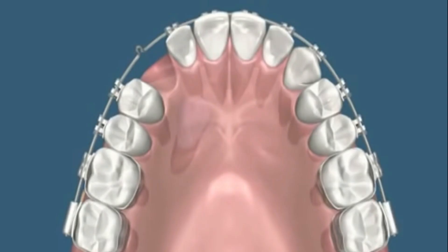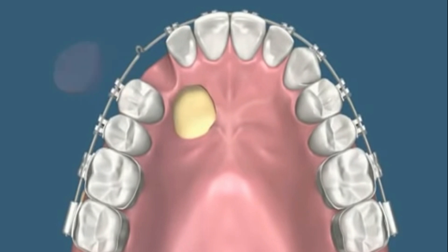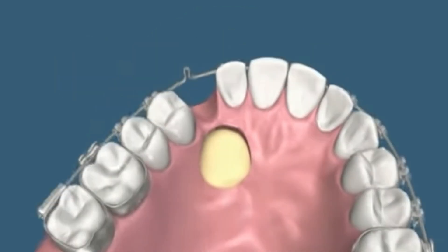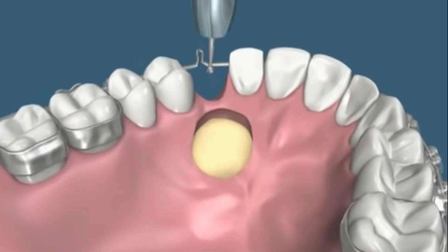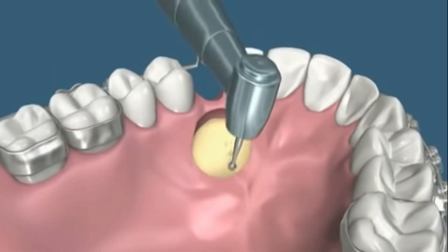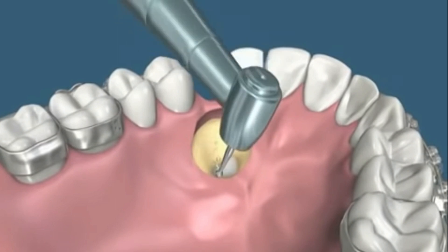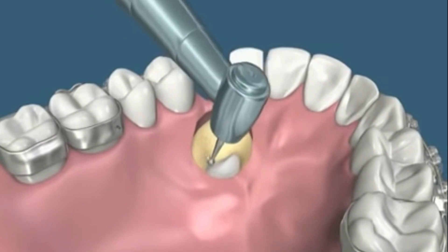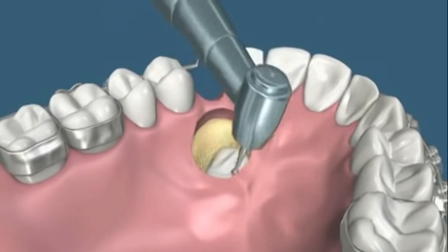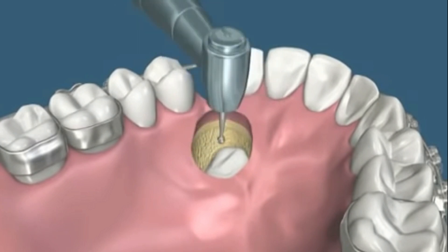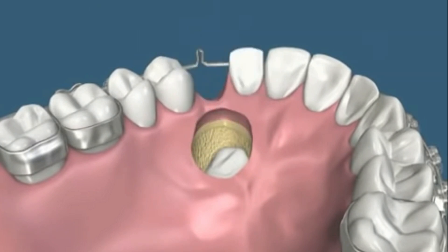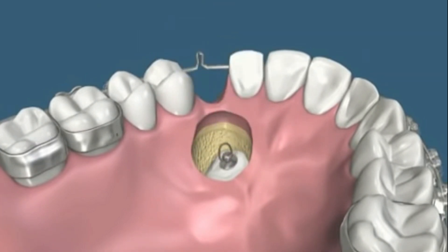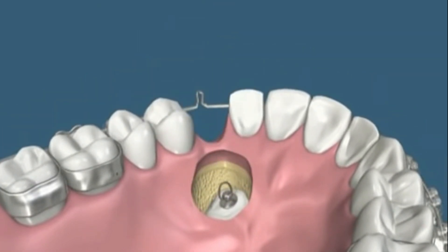The surgical procedure is performed by first raising a flap on the palatal mucosa. With the help of a micromotor surgical handpiece and a round burr, the bone above the impacted canine is removed and the tooth surface is exposed, as seen in this video.